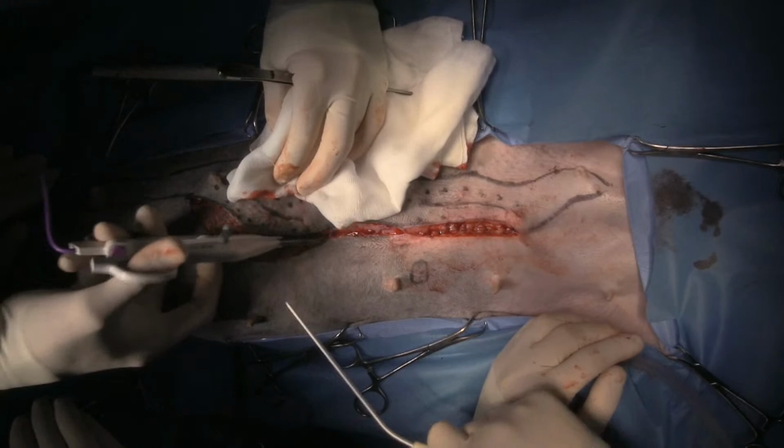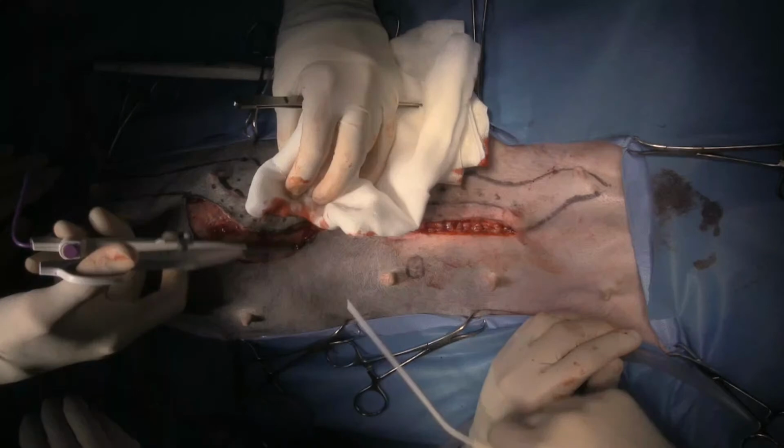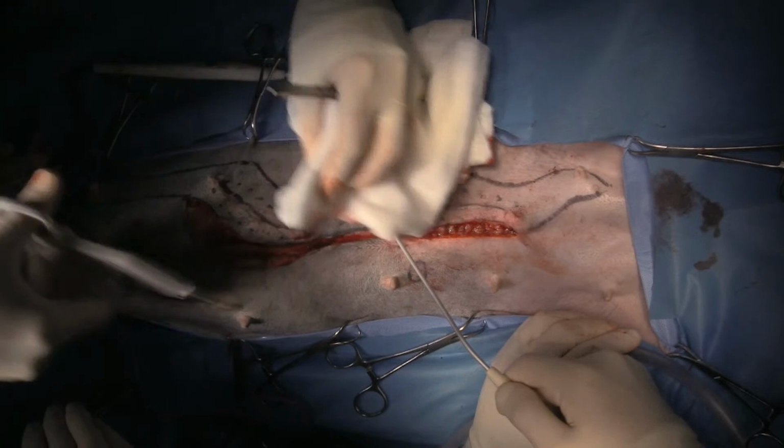A lot of big blood vessels in here, and that's because of the previous surgery. So there's a lot of inflammatory tissue.